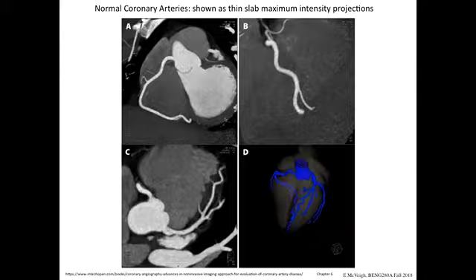You can also take slabs through the 3D volume. Let's take a slab that's, say, about 2 centimeters thick. And we'll just cut it along a direction and cut out the data. So now we have a slab. And through that slab, we'll do a maximum intensity projection.